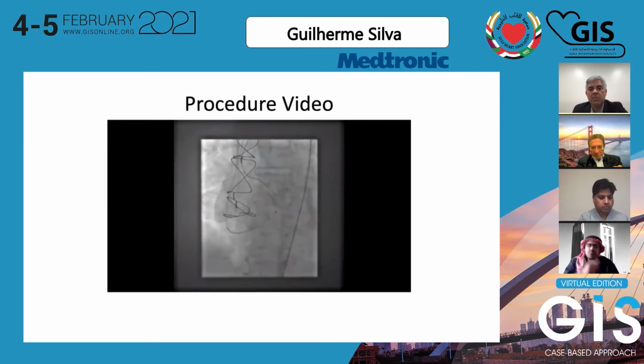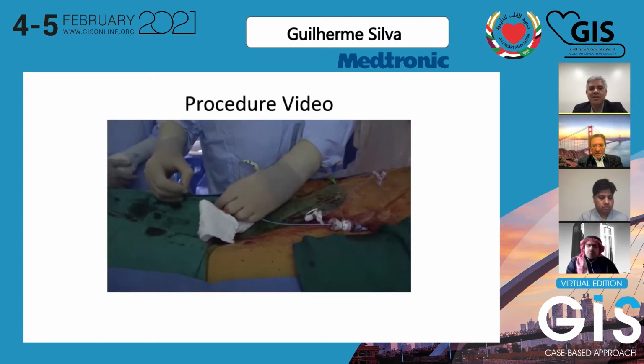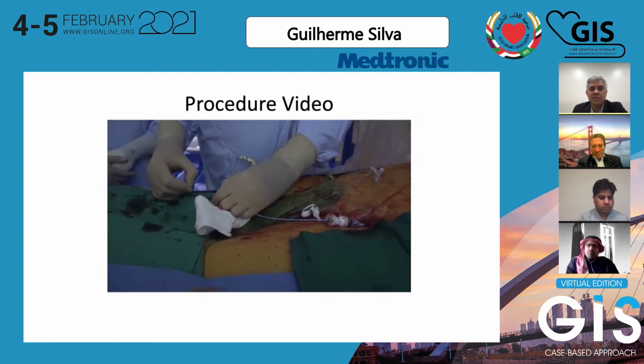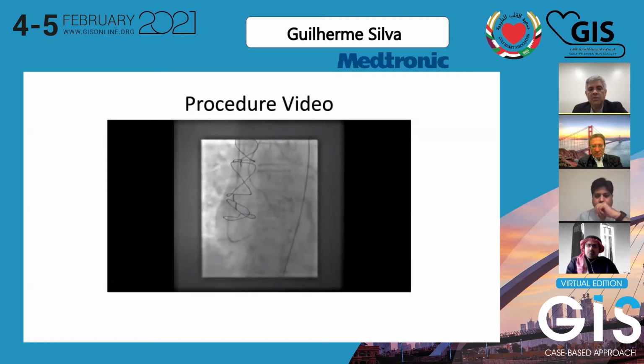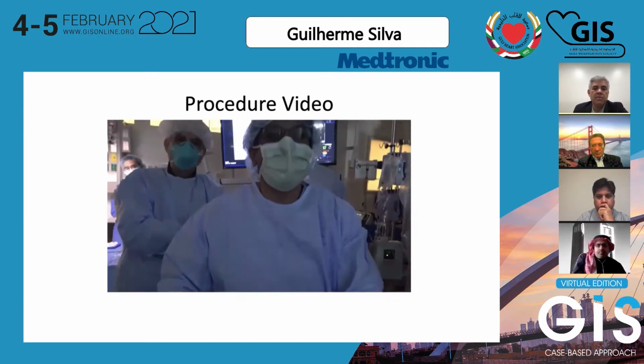And most operators, when they come to my lab, are like, wow, your surgeon crosses the valve. Yeah, he does. He's pretty good at doing this. Those valves sometimes can be hard to cross because you have the post, you have eccentric. So it takes a little time, but he's going to cross right now. And we're careful to make sure that we're not going against or under the mitral apparatus.